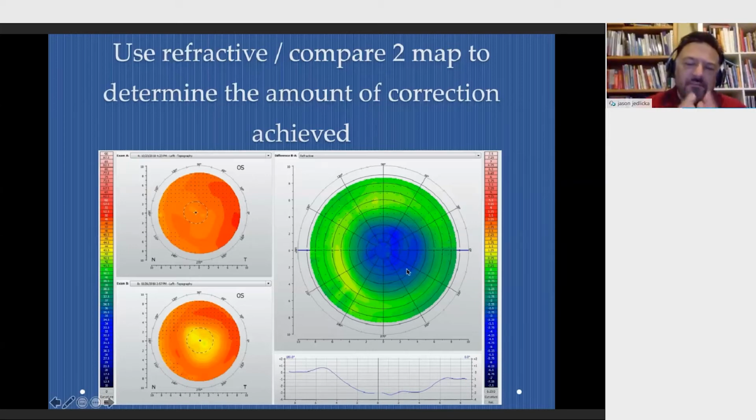So again, if my patient coming into treatment was a 3 diopter myope, then without even checking his acuity, I would predict that he would read 20/20 the minute I walk into the room and have him read the vision chart based upon this. At the same time, if his prescription prior to treatment was minus 3.50, then it would be entirely possible for me to expect that he's still going to complain a little bit of distance blur.